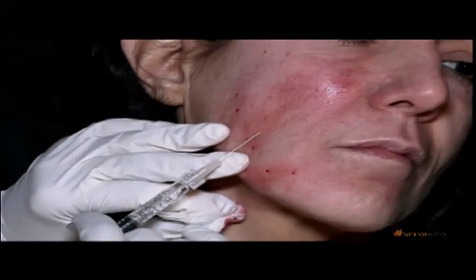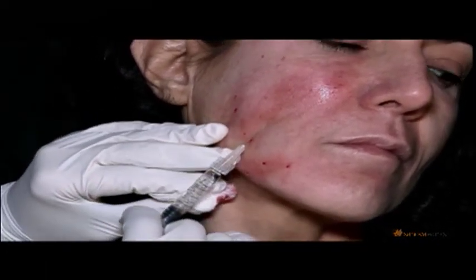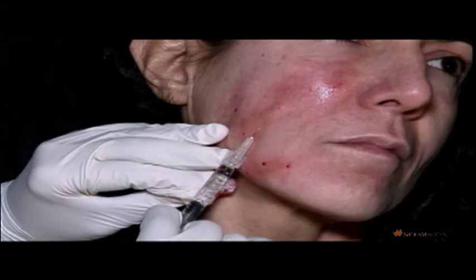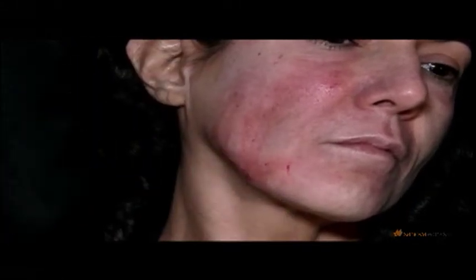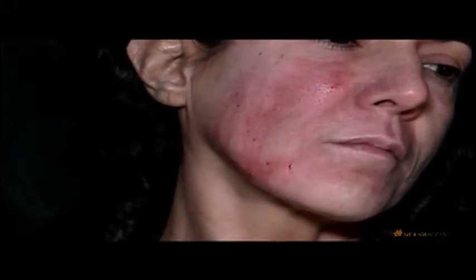And remember, I can only do this with this particular HA because I've diluted it, so that there aren't enough particles to scatter the blue light, which is short wavelength, and cause the Tyndall effect. But Bellaterra Balance has now been approved. It will be available very shortly, and we'll be able to do that without diluting it.